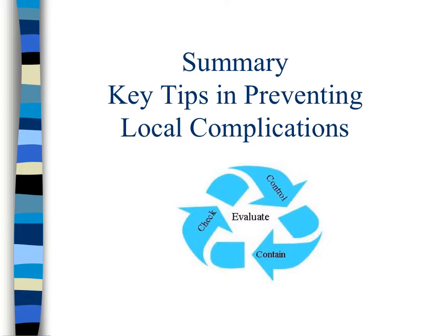It's important for us to prevent local complications. We can do this by adhering to the INS guidelines and institutional policy, ensuring aseptic technique in skin prep and venipuncture procedure, preparing the skin with an antiseptic and allowing it to fully dry prior to catheter insertion, and do not touch the skin after cleansing with the antiseptic.